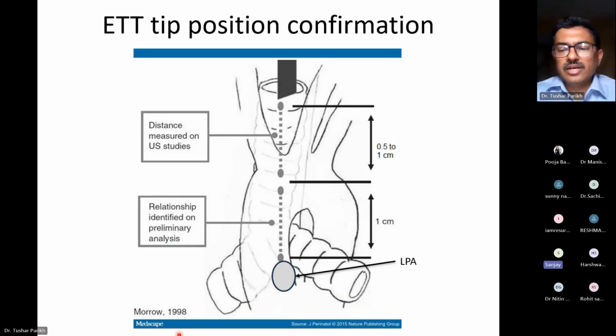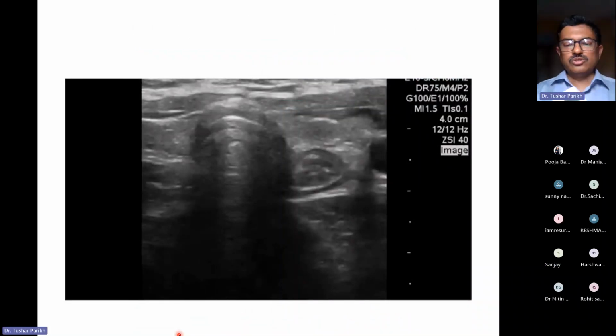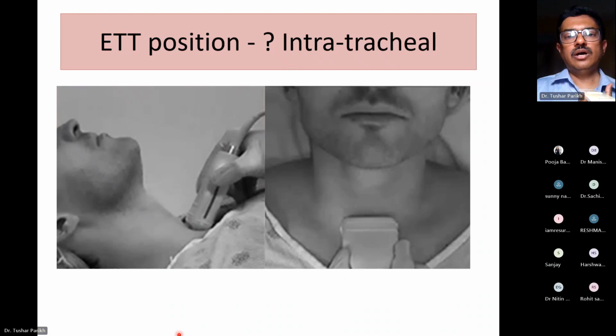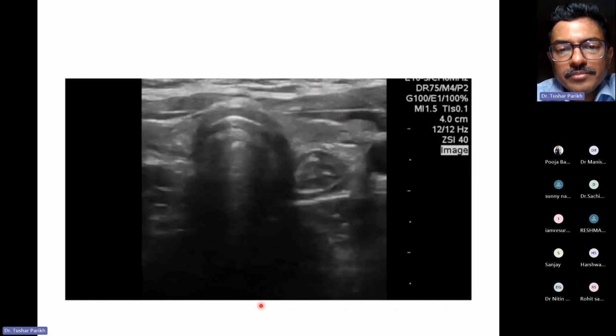Now, does this need to be put horizontally or vertically? Horizontally. So suppose this is the probe, linear probe. You're putting it horizontally like this. So I've shown here in the picture, horizontally like this. So this is again easy to do. It looks a little complicated, but it's very easy to do, and if by mistake it is esophageal intubation, you'll be definitely able to make it out with this.